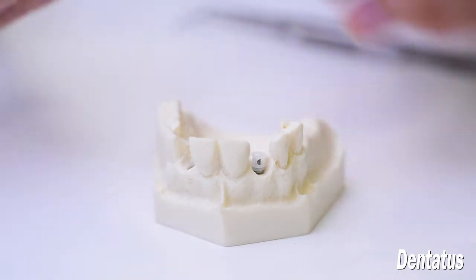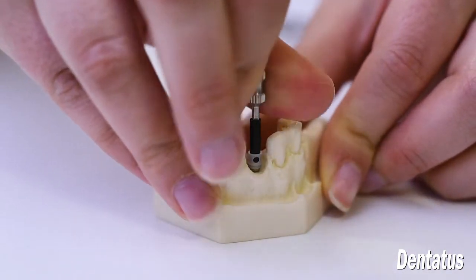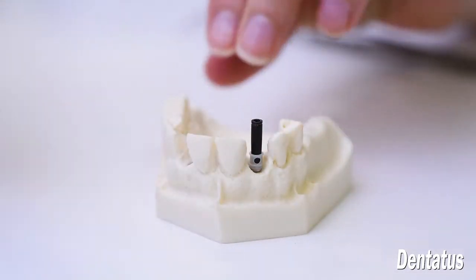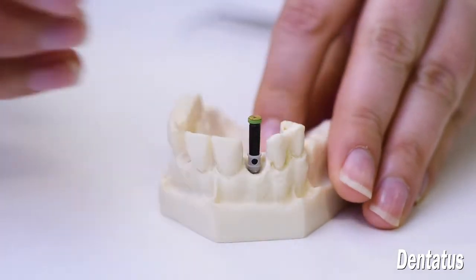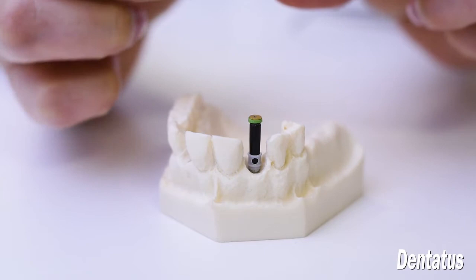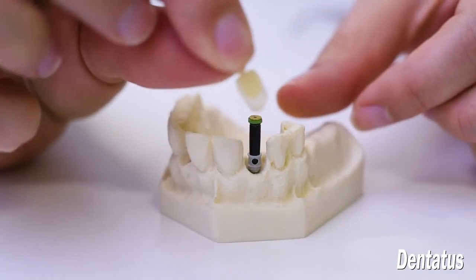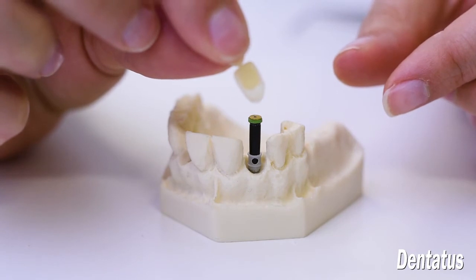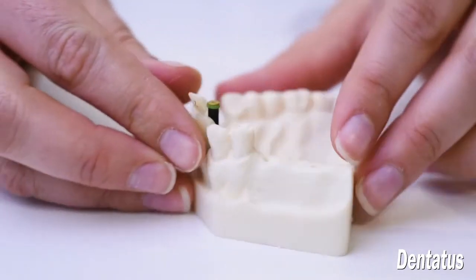It's attached with the black screw cap driver. The cap plug is inserted into the screw cap to prevent resin from flowing into the access. Then you'll take your polycarbonate crown or crown former and cut a hole in the lingual or occlusal surface to make sure that there's access for the screw cap.